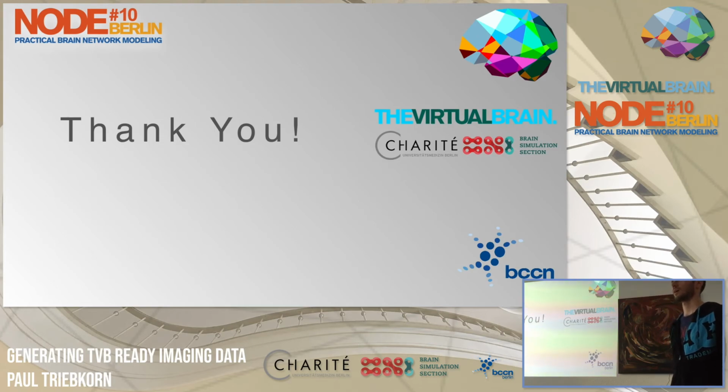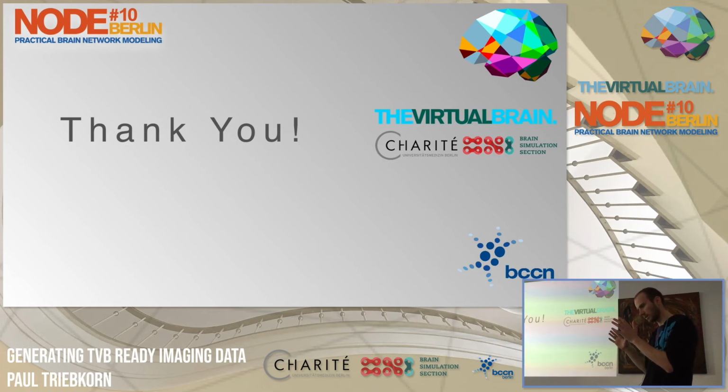So I would say if you identify an issue, or if you're dissatisfied with the preprocessing pipeline, at some point you will have to get your hands dirty and dive into the code and also the images. But a lot of these pipelines also create quality control images. So they print you JPEG or PNG files where you can see, okay, how well did alignment, let's say, between structural and functional, how well did it work? How well did these distortion corrections work? So some of the pipelines offer this capability.